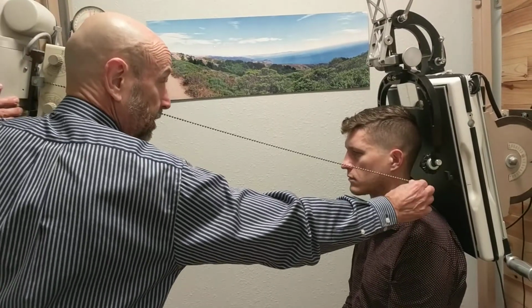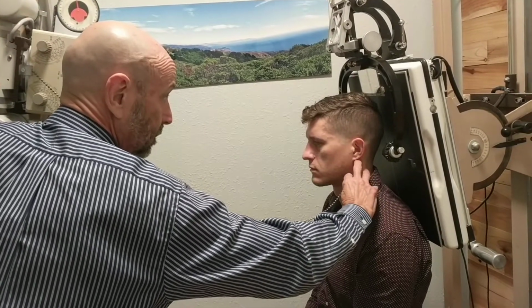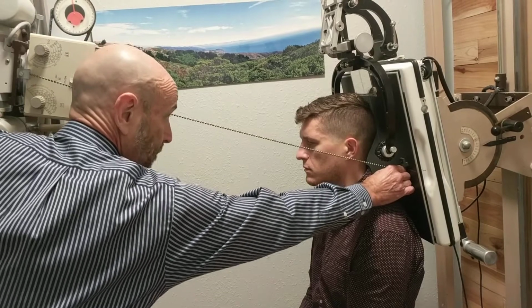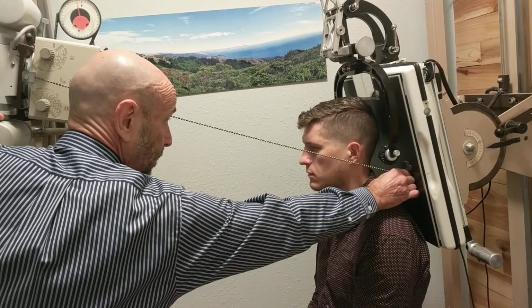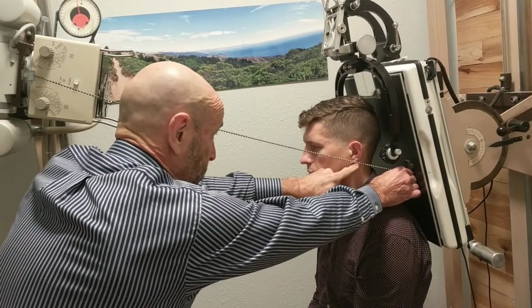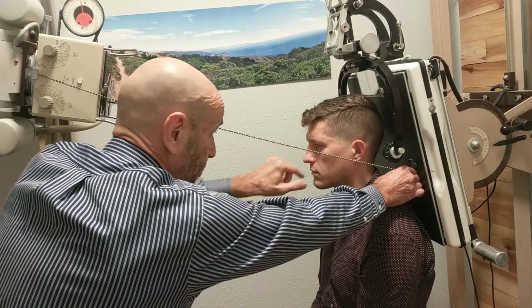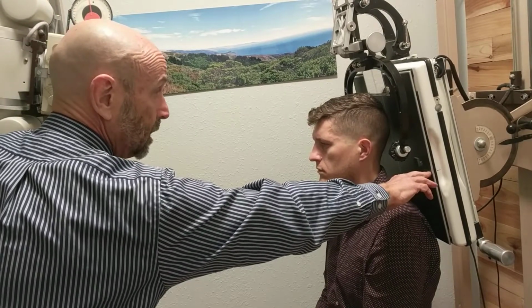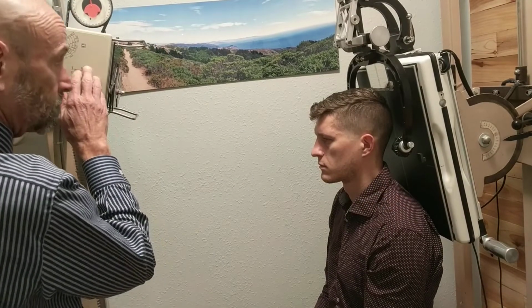So the next thing we're going to do then is once again using the central beam as represented by the string or the chain. We now know off the lateral exactly where the transverse process is. So that becomes the focus around which the tube and the bucky rotate. So on an S3, what we're going to be doing is going through the transverse process. It actually has to go through the inferior orbital margin, and it has to hit the X-ray bucky in the center.